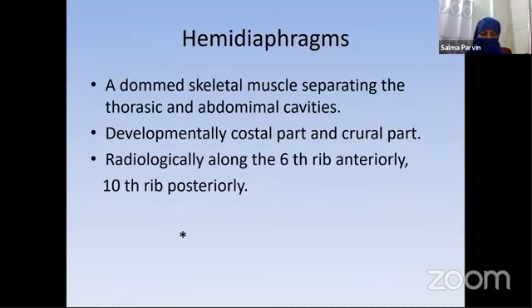So this is most of what I hoped to cover about what you need to display on the X-ray plate, and how to read a normal chest X-ray. These are the things I have presented to you in a simple way. Later on, if you want to continue, I think today is enough load. You go through and rememorize all those things, and later on we will go through other normal things in normal chest radiography. Do you have any questions I can answer?